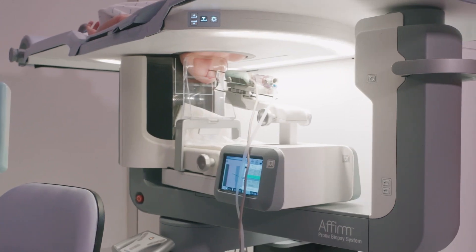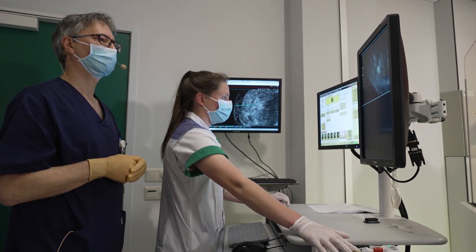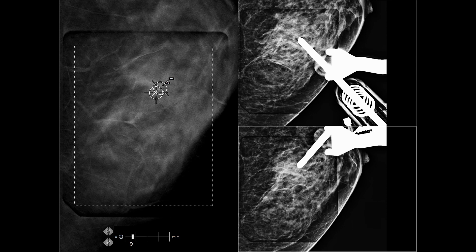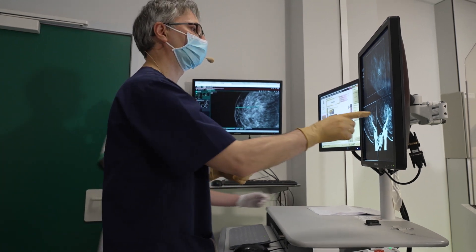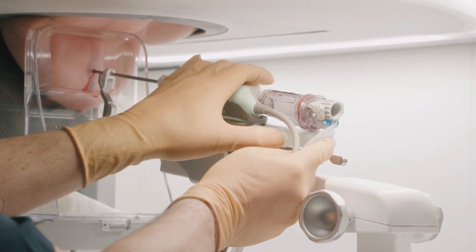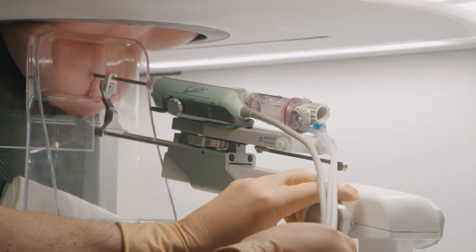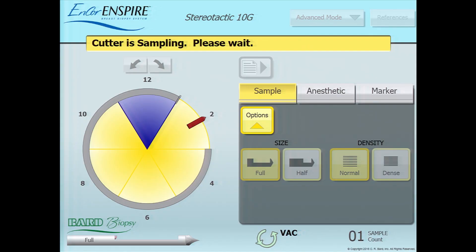We call this the pre-fire position. Before firing the needle to the correct depth position, we take a pre-fire stereotactic set of images to check the correct position of the needle. On this screen, we can see the needle tip projects right in front of the calcifications. We then fire the needle to the correct depth position; the needle will advance 2 more centimeters. Once the needle is in the correct position, we can start taking the samples with the 10-gauge Encore needle.